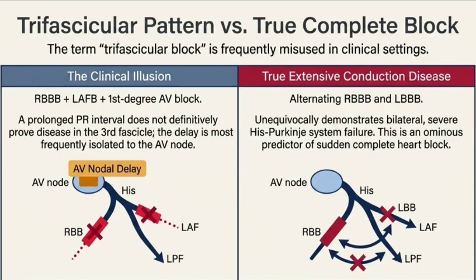But I do need to point out a massive trap here for any new clinician. Oh, what is the trap? You mentioned the letter E in the LEFT mnemonic, exclude. Diagnosing these specific electrical blocks requires mandatory exclusions. Meaning you can't just jump to conclusions. Exactly. A doctor cannot just glance at the paper, see the compass needle pointing left, and scream, left anterior fascicular block. Why is that? Like, are there other things inside the chest that can drag the electricity off center?